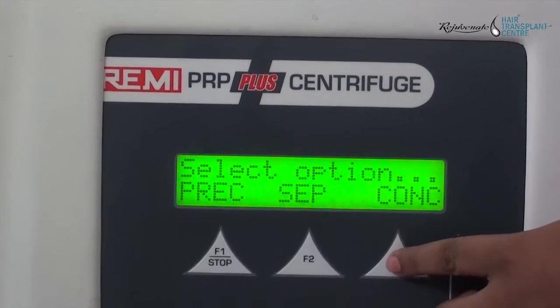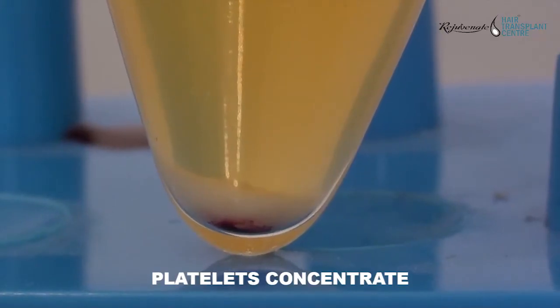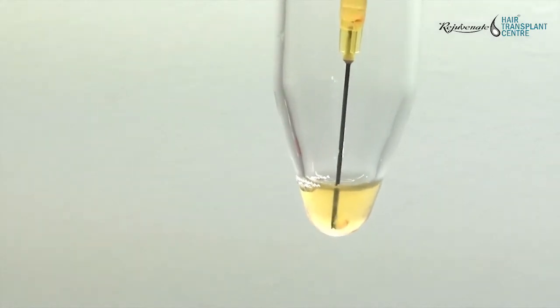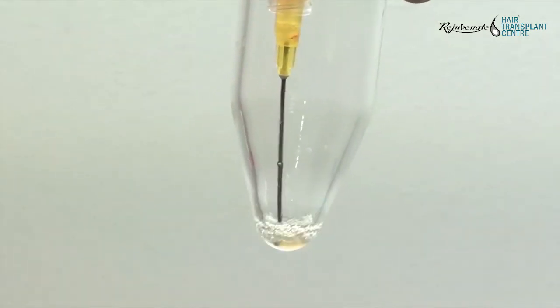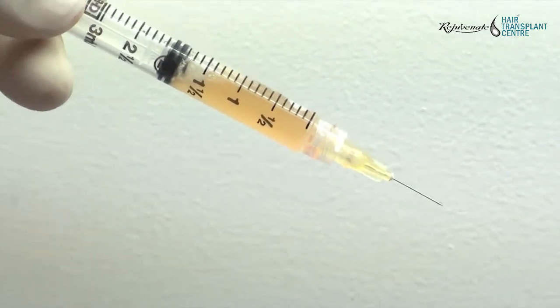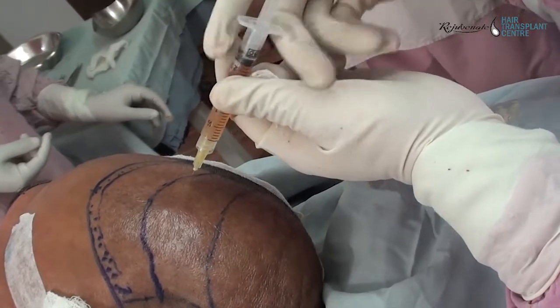The glass tube is centrifuged again to make platelet concentrate at 5000 rpm for 8 minutes. The platelet concentrate forms a plug sitting at the bottom of the tube. PRP is then prepared by mixing the platelets in only 2 to 3 ml of plasma.